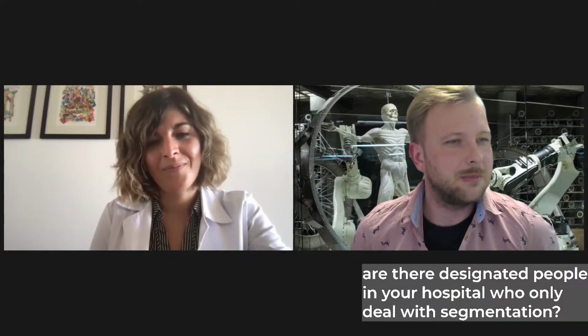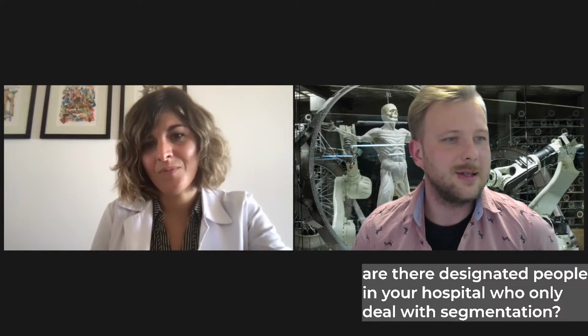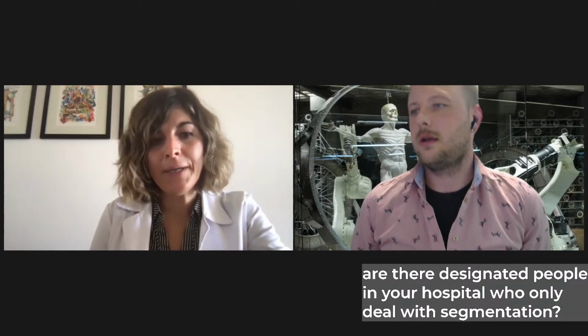So regarding segmentation, Paul is still asking. So the segmentation process, working in the program, is made by a radiologist, right? Here, yes. We, as I was telling you, have sometimes the help of an engineer, but our hospital is a very low income hospital, like a state hospital. So we don't have much money to hire as many people as we would like to.